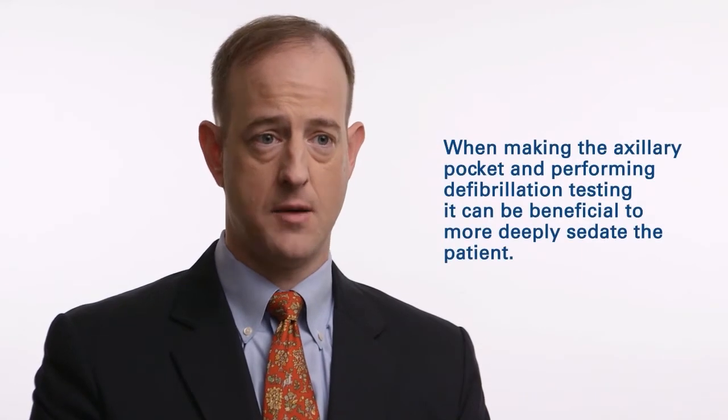I would say that thought process has changed over time, because the vast majority of device implantations are not significantly more challenging or difficult than a standard ICD implant, and we have found certain times during the implant where more anesthesia could be beneficial for patient comfort, such as making that axillary pocket, or of course during defibrillation testing.